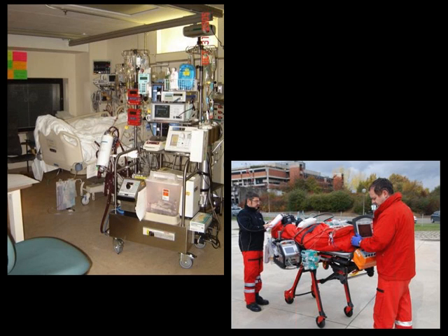In the last 7 years, there's been a tremendous change. What you see on the left-hand side of the screen is what a circuit looked like when I was a resident at the University of Michigan that still used a roller pump, and all the technology that you see here has a silicon membrane, etc. What you see over on the screen here on the right-hand side, and I don't have a laser. Do we have a pointer of some sort? Oh, here we go.